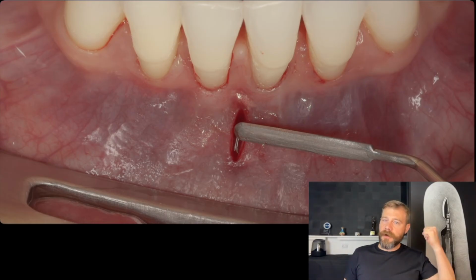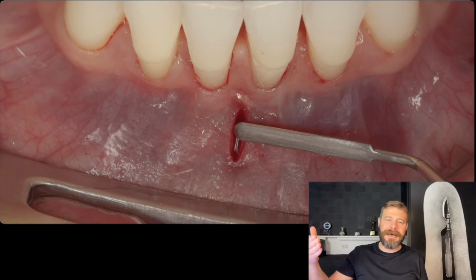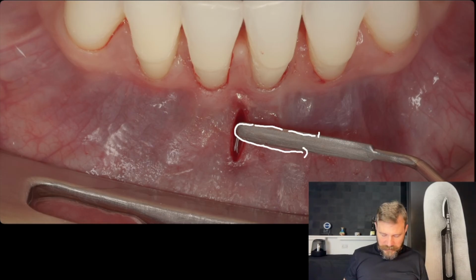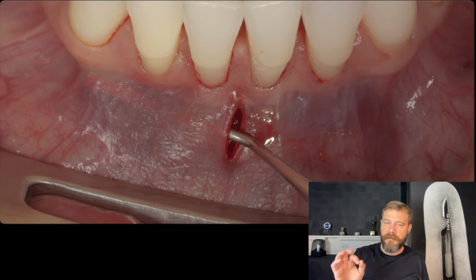Here we're doing the same job as in the previous slide, but I'm doing a side entrance. So the whole separation of the mucosa from the muscles, I'm doing here with the same instrument, but with a lateral approach. And you see here that the instrument is sharp from here to the tipping point, all the contour returning. So all this part is super sharp. I can go from the modified VISTA approach or modified VISTA incision, and I can detach the muscles from the mucosa in a very clean way. So this instrument also was developed for this side entrance here.